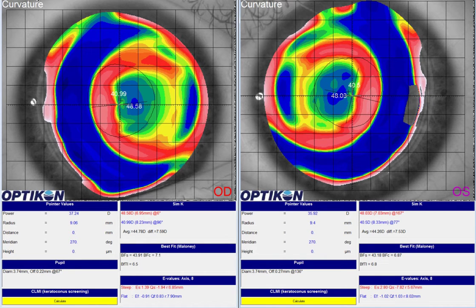In this orthokeratology case, we have a patient whose lenses are decentering nasally, pretty markedly. The patient is seeing well, but we're going to see if there are some changes we can make to the lenses to get them to center a little bit better.